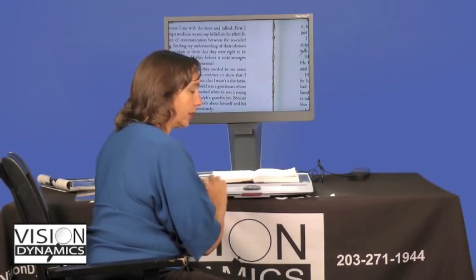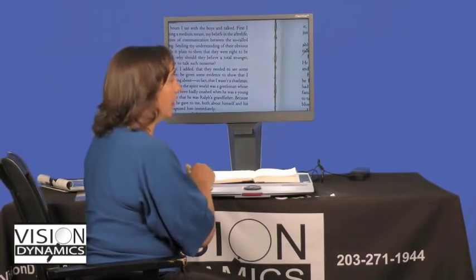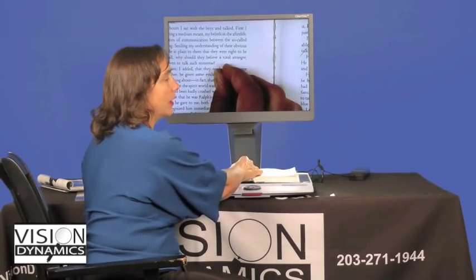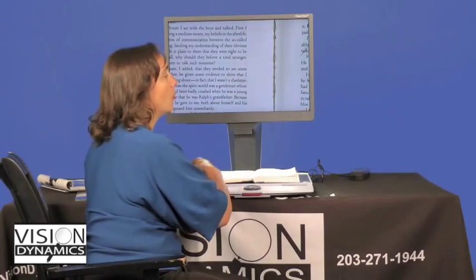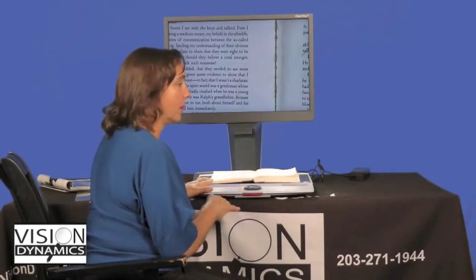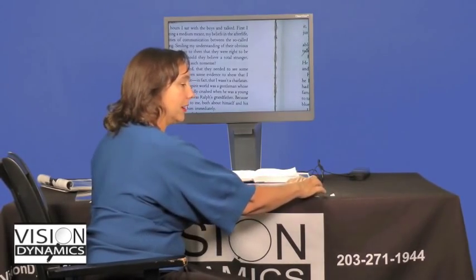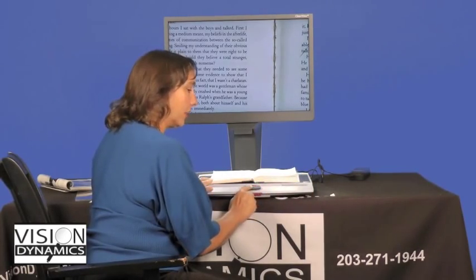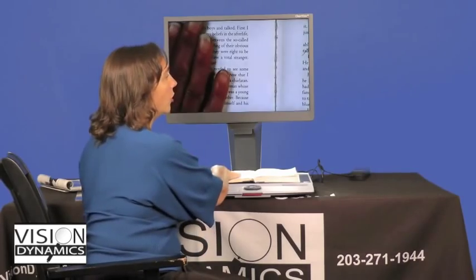There's going to be a red circle that lights up. That's going to tell you the focus lock is on. So what's going to happen now is the focus is going to stay locked on the paper. It's not going to try to focus on my hand or the pencil. So that way I can go ahead and start writing without seeing the focus changing. And then when I want to shut that off I just press that pencil button in again, the one with the pencil picture all the way to the right. And the light will turn off on the dial. And we're back to auto focus.